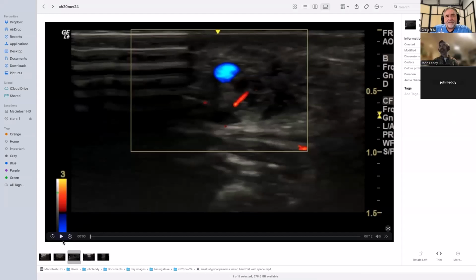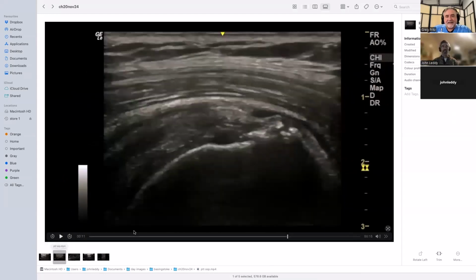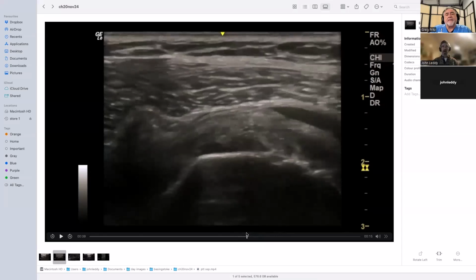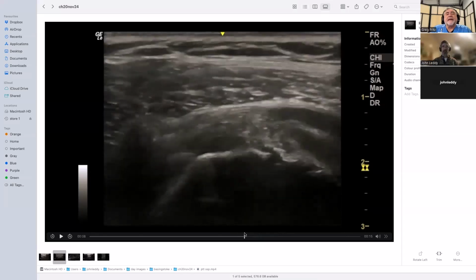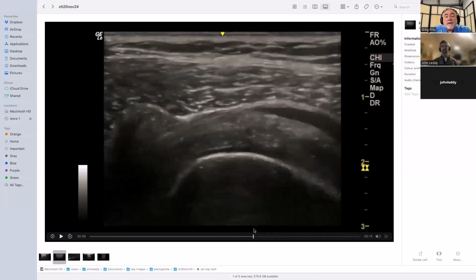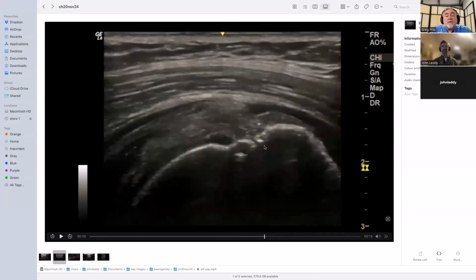On that last one, if you had to guess a percent of cross-sectional area that remained viable, would you be saying we're at about 50%? Because it looks to me like at least the anterior fibers, it doesn't look like it's a complete tear. This is a small tear, even though it's on both sides of the tendon, it is still less than 25% of the tendon, I would have said, in terms of depth across.